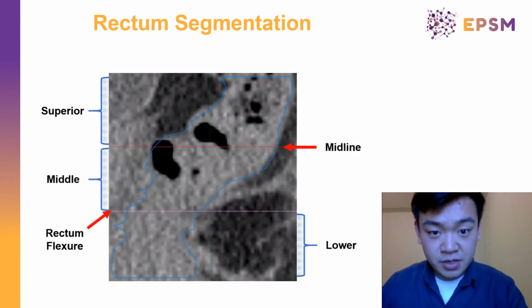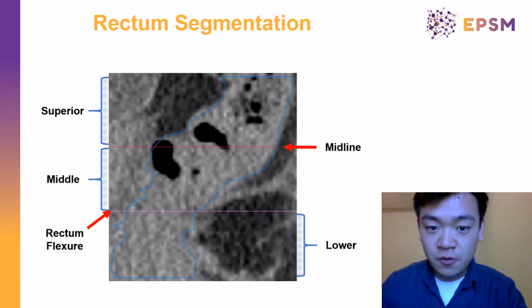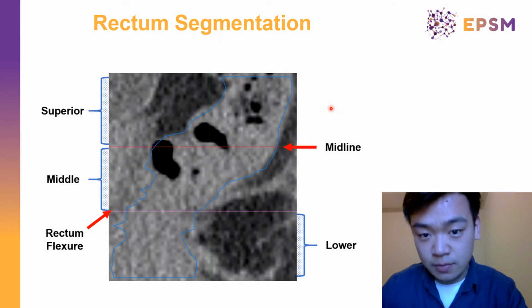Unlike the bladder with a spherical shaped geometry, the rectum has a tubular geometry. This geometrical shape and the complexity of surrounding organs result in complex rectum wall displacement and non-uniform motion. For example, the superior part of the rectum usually sees a larger wall displacement compared with the lower part of the rectum. So, before we generate the rectum PRV, we better segment the rectum first.